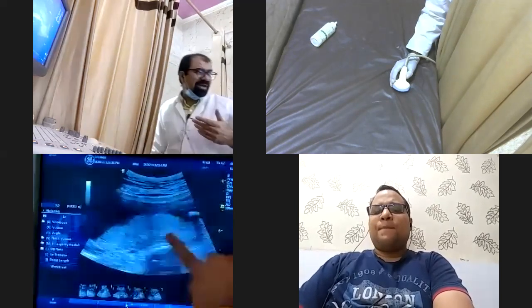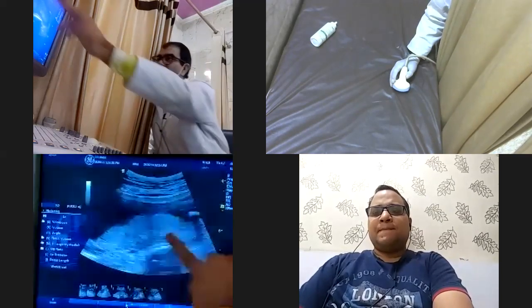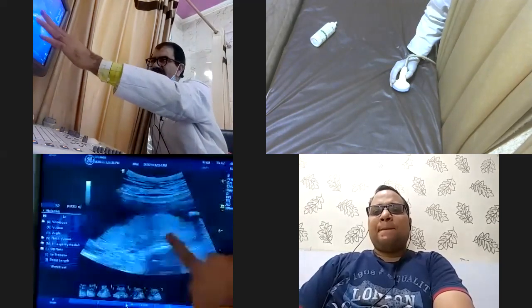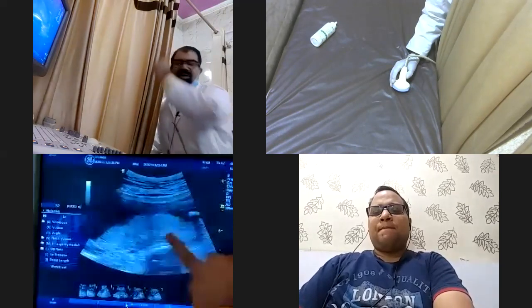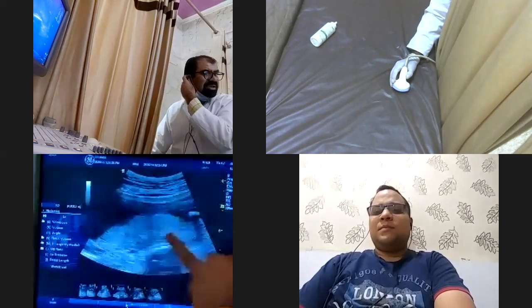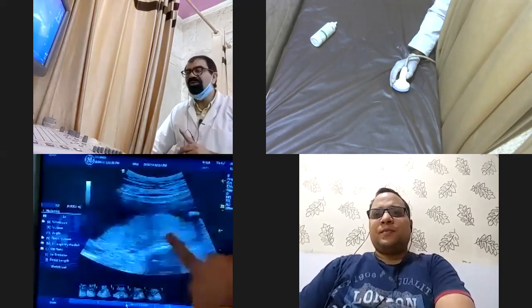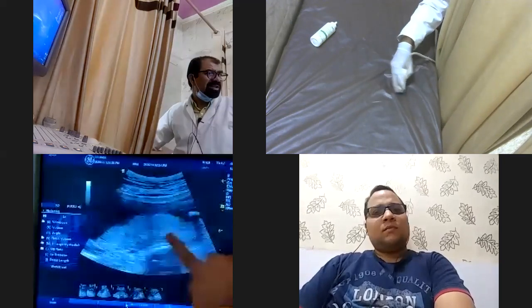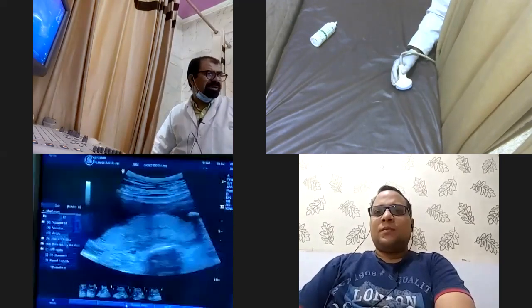But the point is, if you did not know the screen orientation, would you be able to give me the location of the placenta like you gave me the posterior placenta over here? Never, sir. This way you have to be very clear with the screen orientation and the movements of the probe. Done?